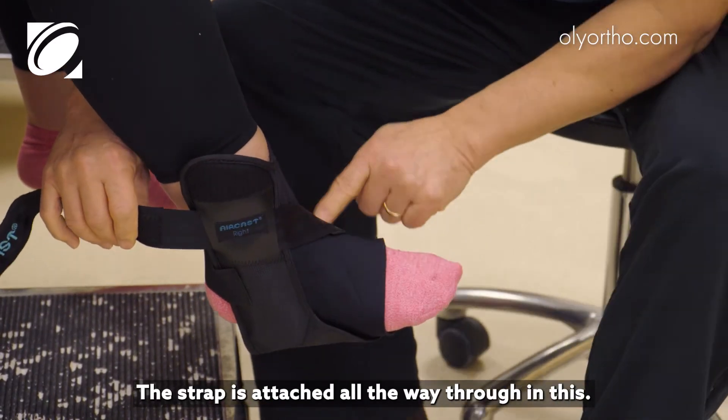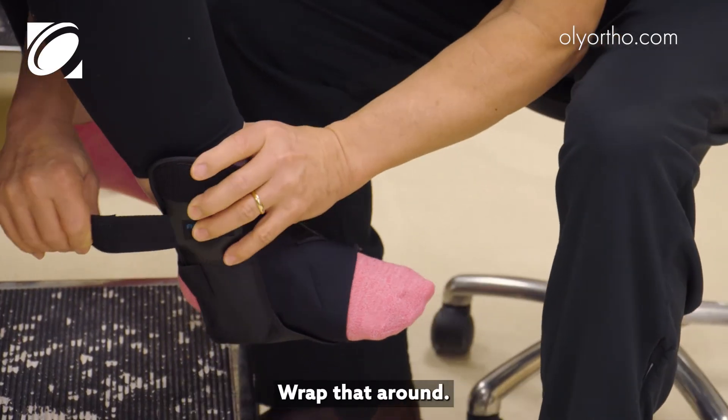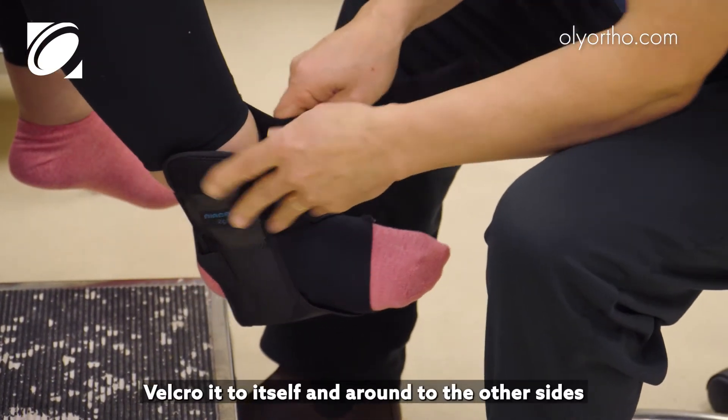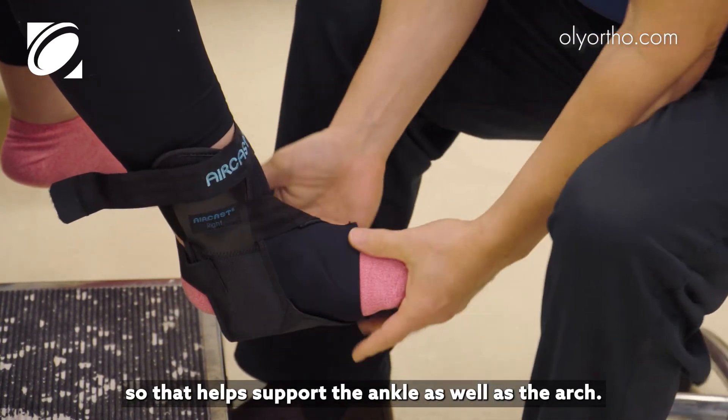The strap is attached all the way through, and you basically pull it — that helps support and pulls up on the arch. Wrap that around and velcro it to itself and around to the other side, so that helps support the ankle as well as the arch.